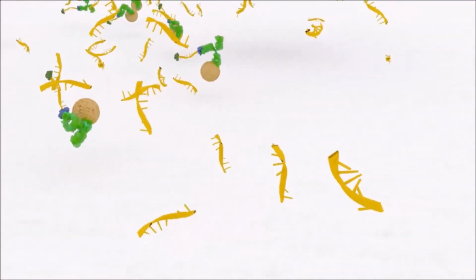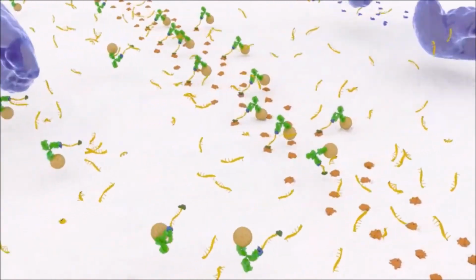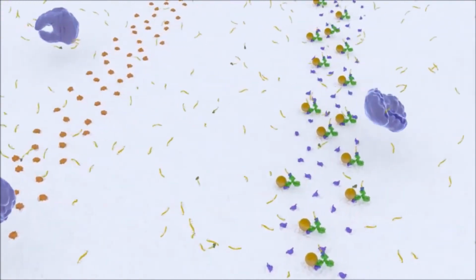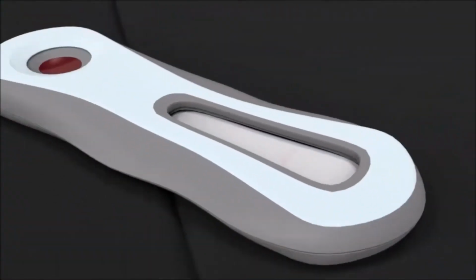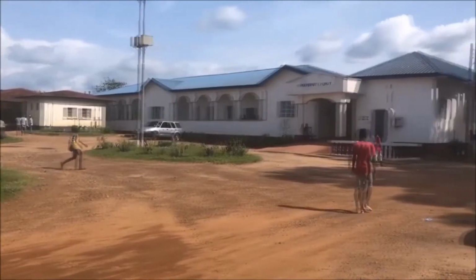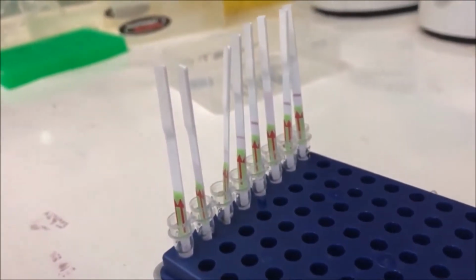If the sample is negative for flu, the reporter remains intact and collects at the first detection line. If the sample is positive for flu, it collects at a different location, making a diagnosis easy to spot. So easy, in fact, Sherlock can be used in the field to detect emerging infectious diseases and outbreaks like Ebola virus.